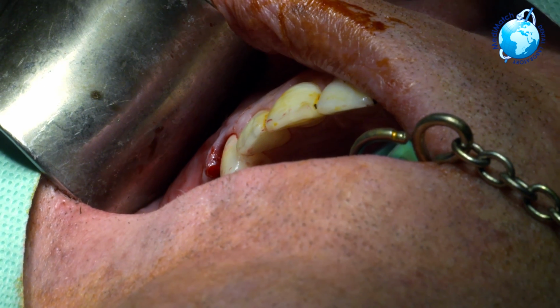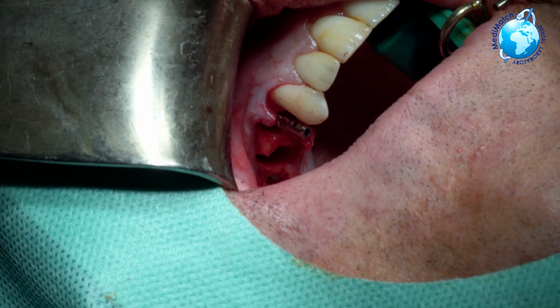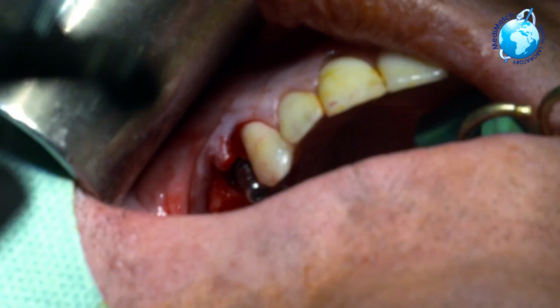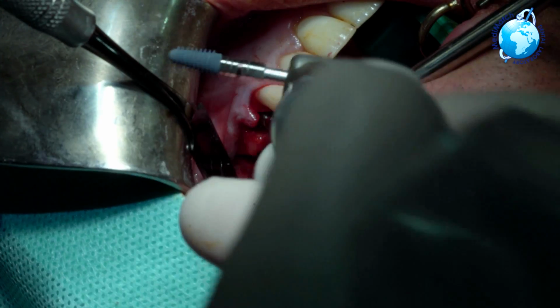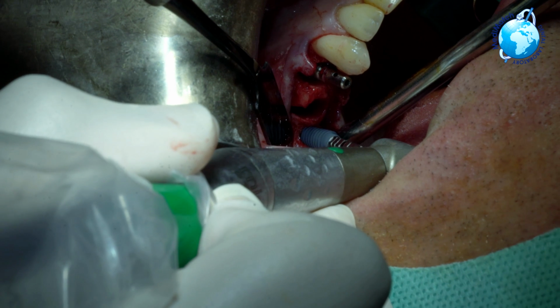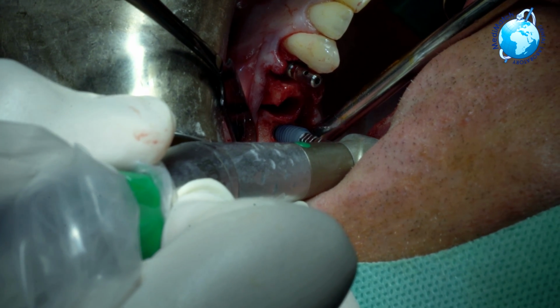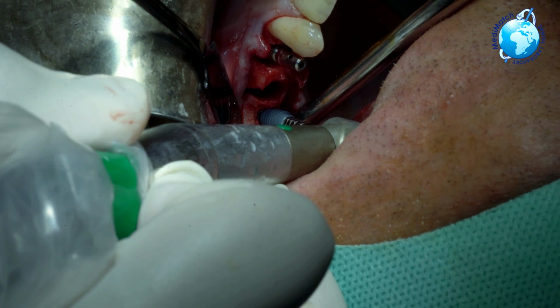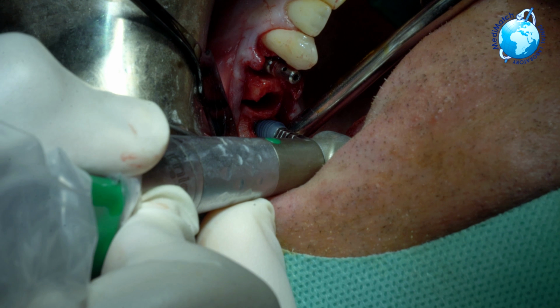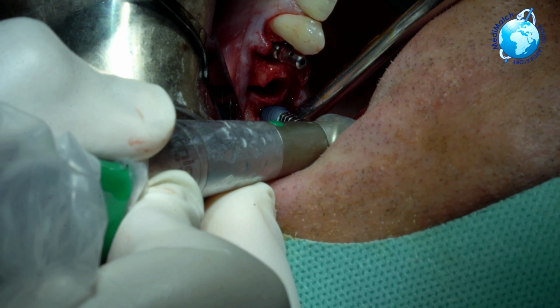Okay. Mode 3, placement. Second implant's going in. Sinus lift done. Another beautiful Megagen implant. I'm going to try to use my rings away. And you can see how simply this will just find its way. 8, these would be big numbers. 14, 15, really gripping on. 19, 21, 24, 27. Okay, don't worry, just tell me every 5.